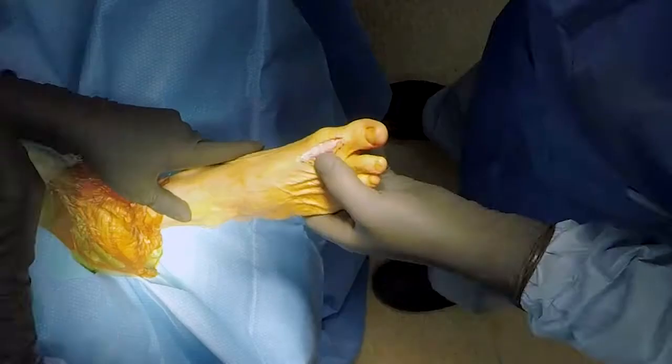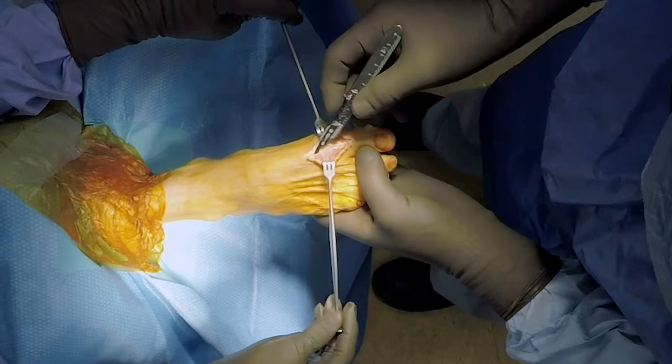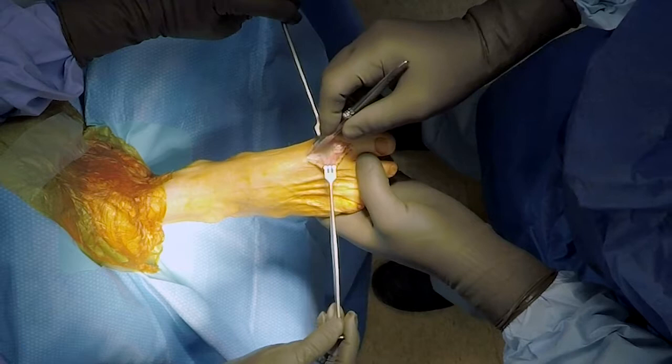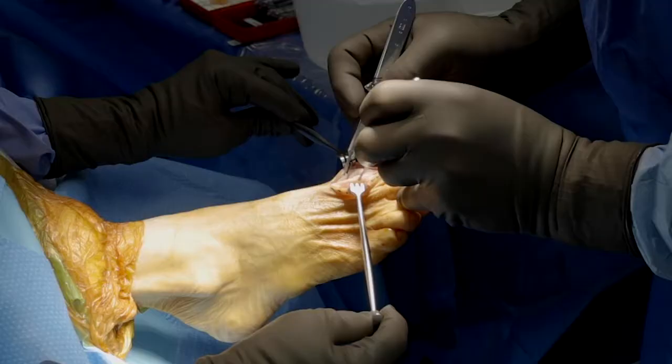Once I get that, I can see the extensor hallucis longus sitting in its sheath right along here. If I can keep it in the sheath, I prefer to do that. I know that my dorsal medial cutaneous nerve is going to be way over on the more medial side. So if I can keep the extensor hallucis longus in its sheath, I just go on the medial edge of that, literally straight down the bone, right over the joint, going right down through the capsule.